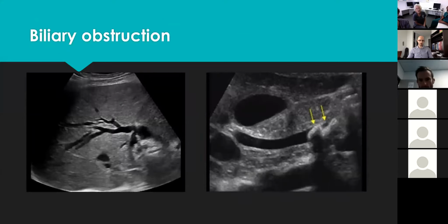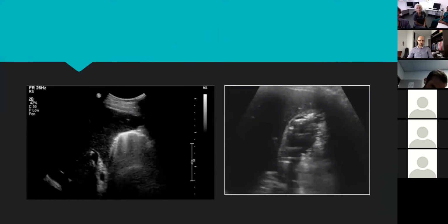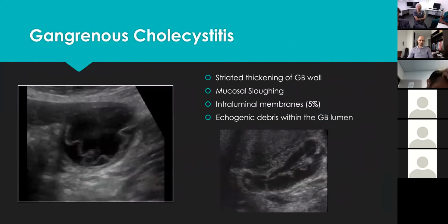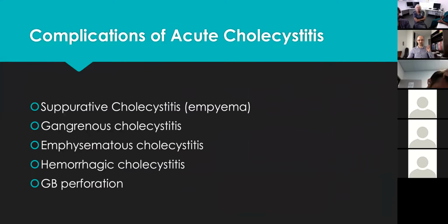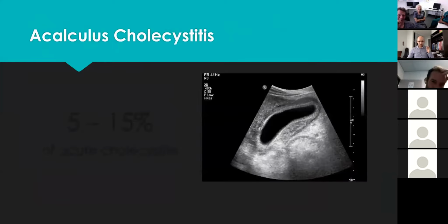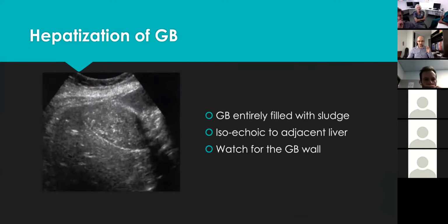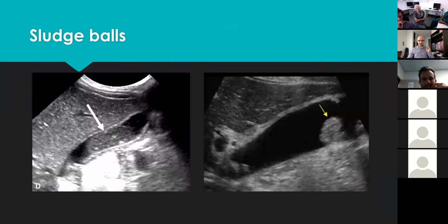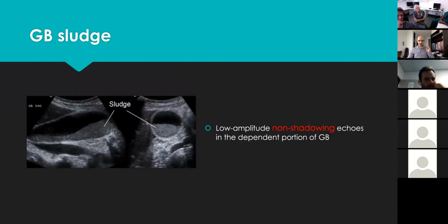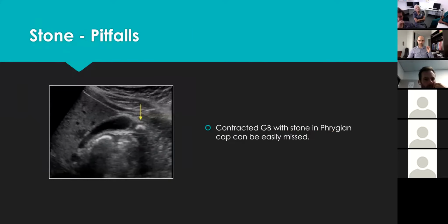No, it was very bad. Because that was actually a clean shadow after that stone. Oh, was it? Yeah. It didn't look very clean, because those previous ones were pretty much the perfect sort of clean shadows. It's not always that perfect. Yeah, but if it doesn't look black, then you can't say that there's a clean shadow, can you? It's still more hypoecho in comparison to the surrounding.